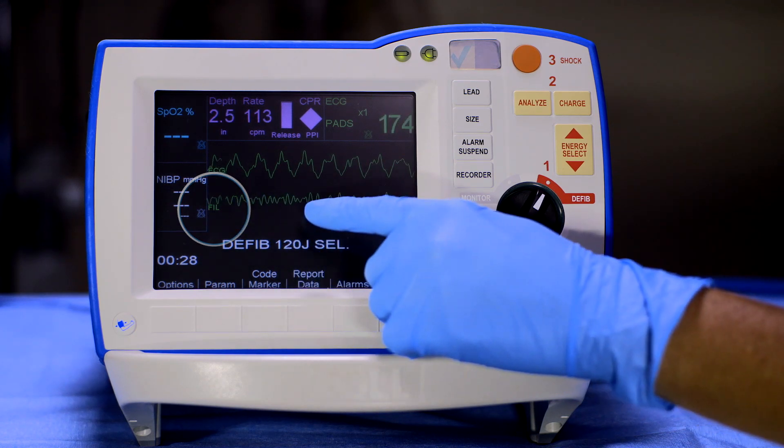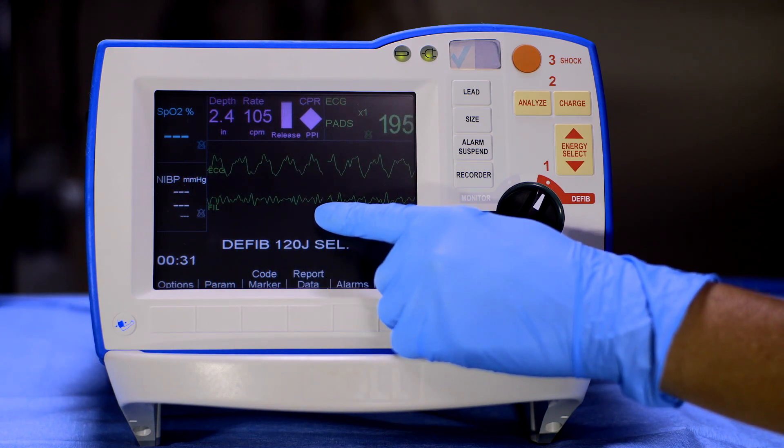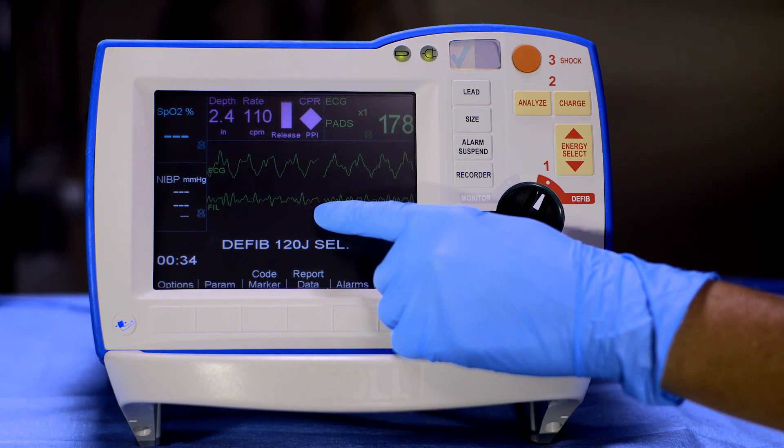This allows you to view underlying rhythms without the need to interrupt compressions. However, it is not intended to replace assessment and it does not work in advisory mode. CPR compressions should be paused when assessing the ECG for a shock or no-shock decision.